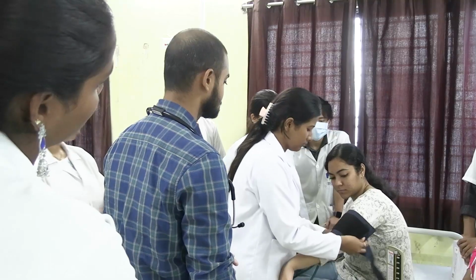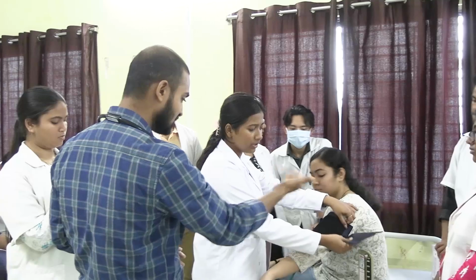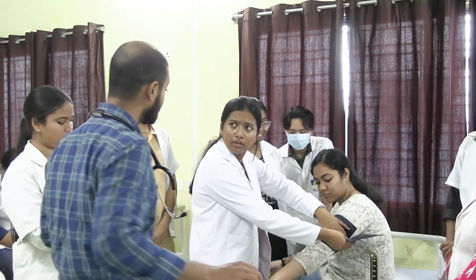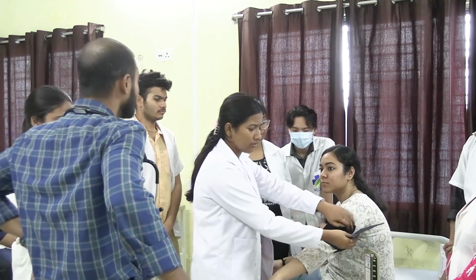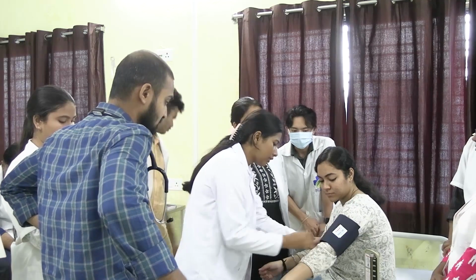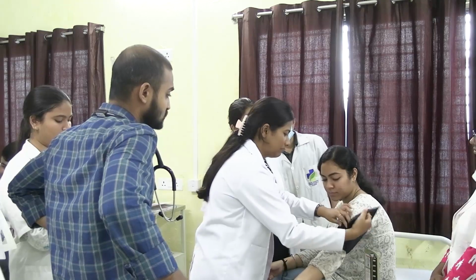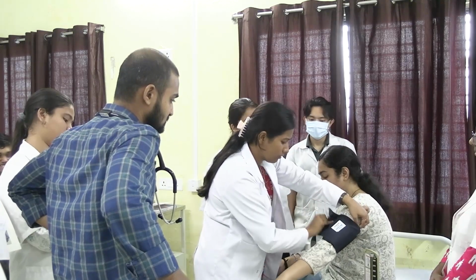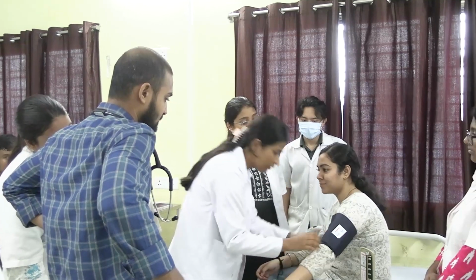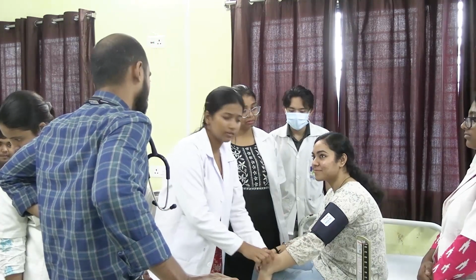Yes. And the position should be above the cubital fossa. And it should not be too tight or too loose. How will you understand? At least two fingers should fit, okay? Is it? Okay.